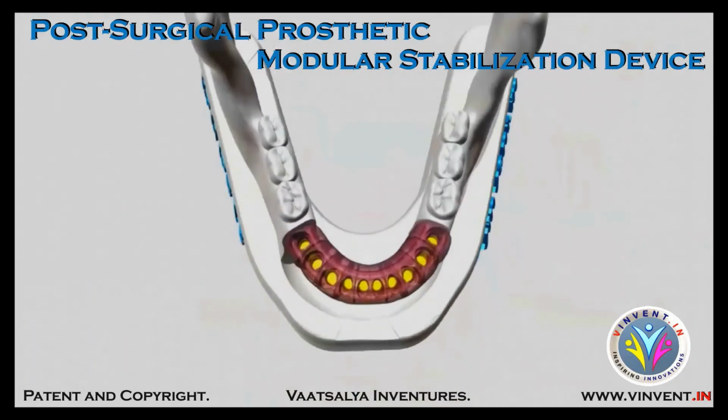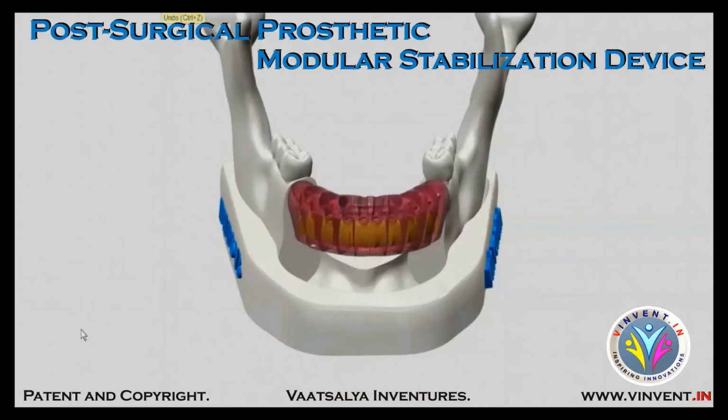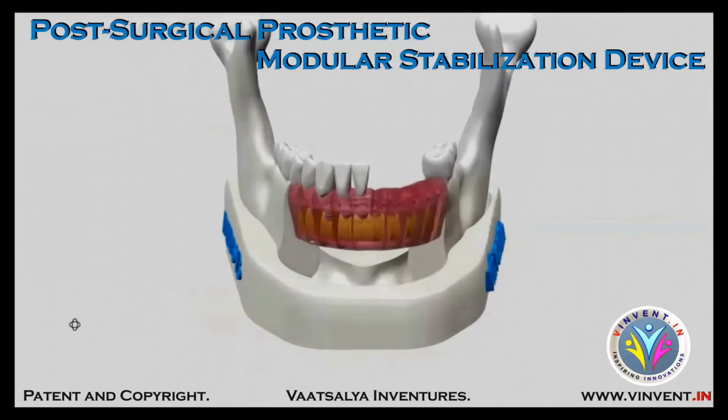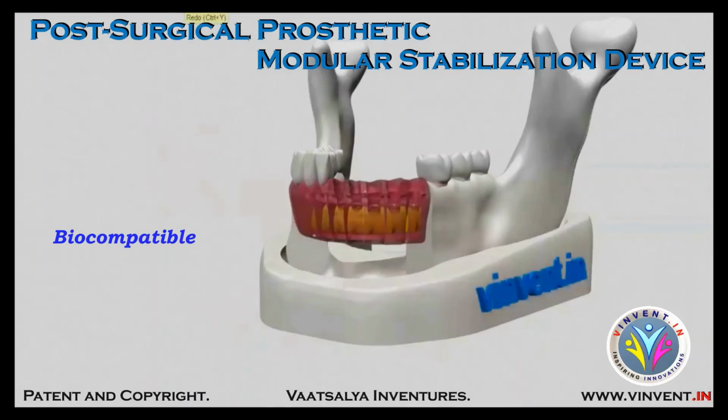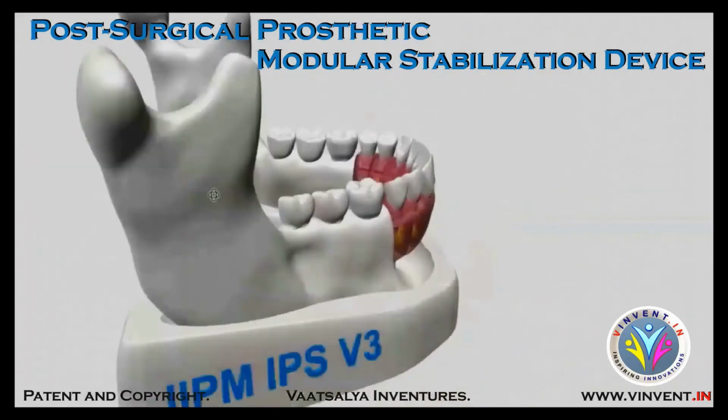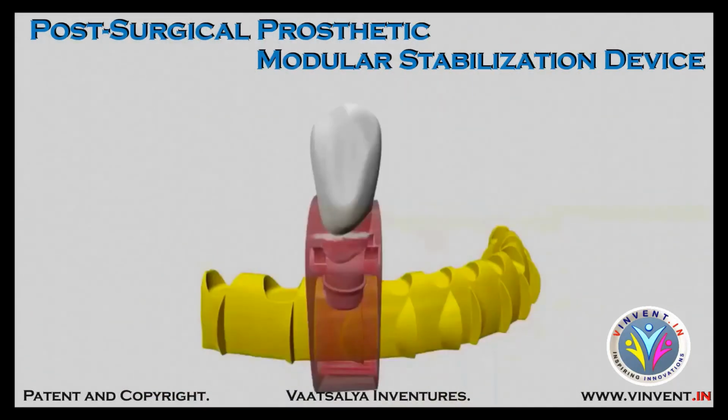The third and the most important component of this particular device, that is the teeth, are individual teeth units made up of biocompatible denture resin, which is suitable for 3D printing by DLP or SLA method. Now, these teeth resins are available in different shades and they are specifically designed and made for this particular application.